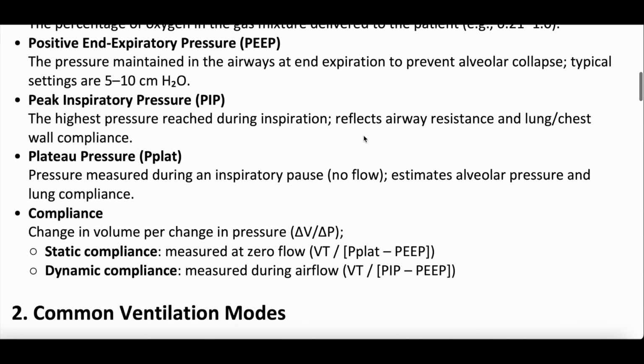This is an important one, and it's a concept that is not that hard to master, but you do have to just think about it for a minute. So this is the pressure that is maintained in the airways at the end of expiration. The pressure maintained in the airways at the end of expiration.